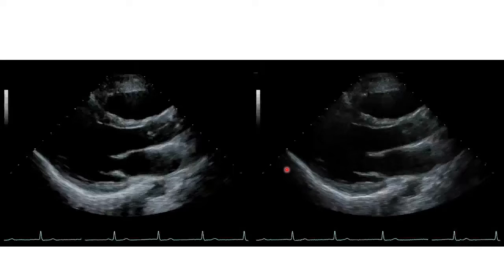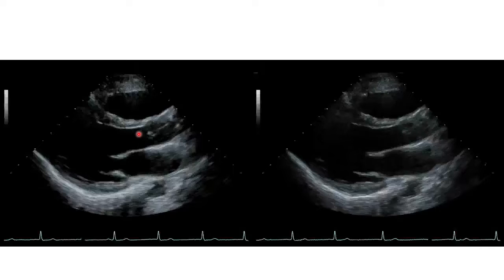The importance of having more grayscale maps is that if we change the map, we can detect various structures which are not otherwise visualized. For example, an LV thrombus — if we change the map, the thrombus may become very evident because it has a different shade of gray. Various structures can be made out more clearly when we change the map. Generally we go with the default map, but in certain scenarios — when we are suspecting a thrombus or a vegetation on the aortic valve — we can try changing the grayscale map to look for more details, and it may appear more evident.